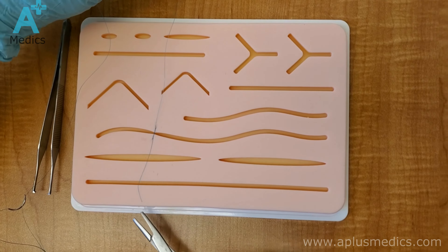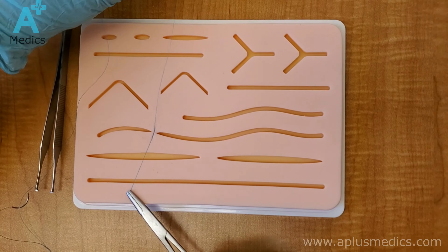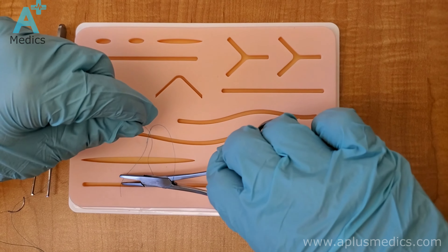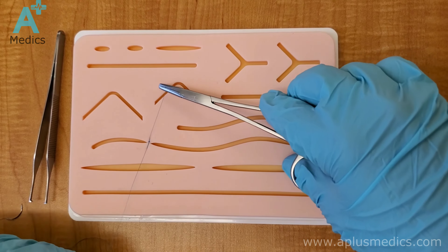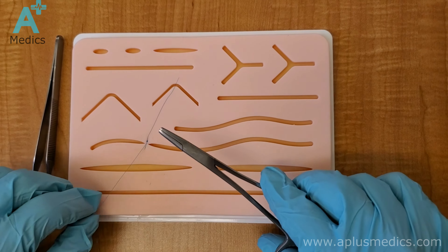Now reset again by putting your instrument parallel to the cut, just like you did in the beginning. But this time you only do one throw around your instrument, then grab the short end and pull your hands again towards opposite sides. Always pull your hands towards opposite sides. Keep doing this until you have at least four or five throws on the knot.